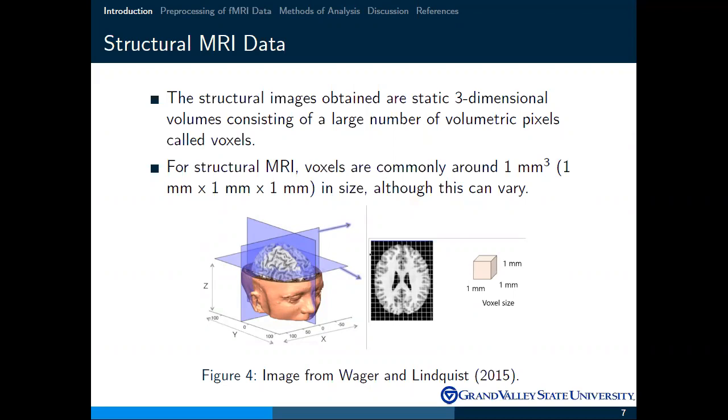So they have to be stitched back together to form the whole image. That's another step that needs to be accounted for in pre-processing. So the resolution would be the same, but there is the issue of needing to stitch it all back together. Thanks. Yeah.